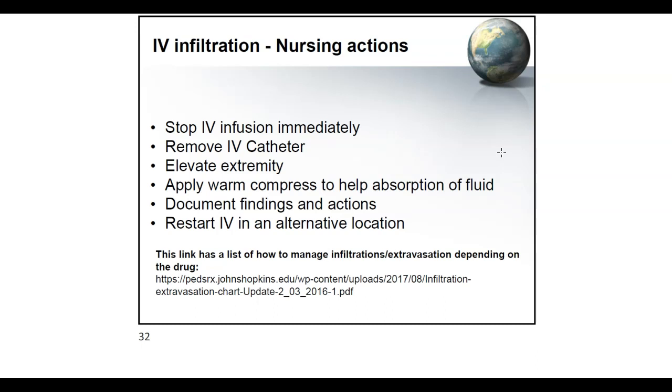Anyway, if the patient still needs an IV, still receiving some sort of IV therapy, then you may need to restart an IV in a different location. Try to avoid that area because not only is it going to be painful, but it's also going to be really hard to find a vein in an area where it just infiltrated and everything is quite swollen. So your chances of getting an IV in that area are actually pretty low.